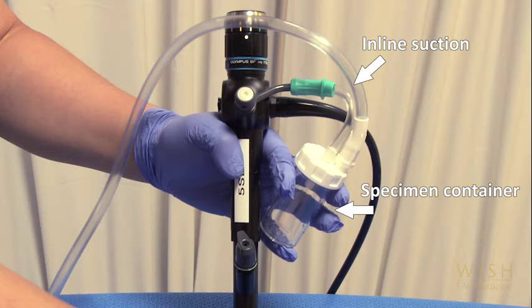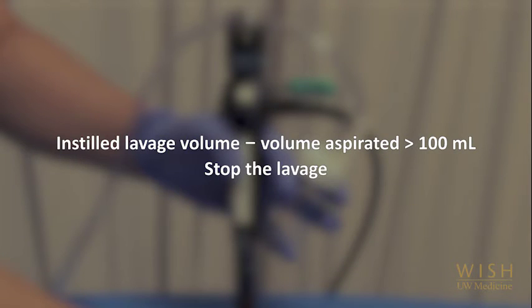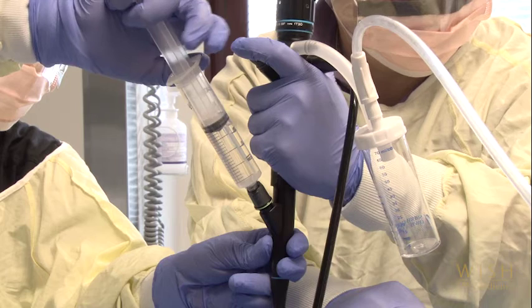Next, a sterile specimen container, commonly referred to as a Lukens trap, is attached in line with the suction tubing to the bronchoscope. The lavage fluid is retrieved by suctioning through the bronchoscope into the specimen container. If the difference between the instilled lavage volume and the volume aspirated is greater than 100 milliliters, it is preferable to stop lavage in that particular segment. Once an adequate volume of aspirated lavage fluid is collected, the BAL procedure is terminated.